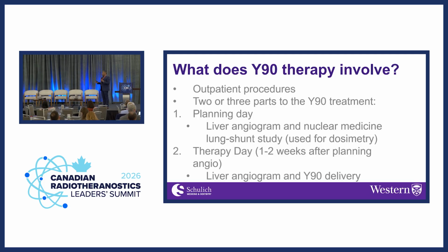It generally involves outpatient procedures through interventional radiology, which is my specialty, but it involves nuclear medicine, obviously, because it's a radioisotope. There are a couple of outpatient procedures. The first procedure is what I call Google Map Day, where we map out people's liver and map out these liver cancers within their liver through the arteries, because they tend to be hungry tumors that are fed by the arteries themselves.